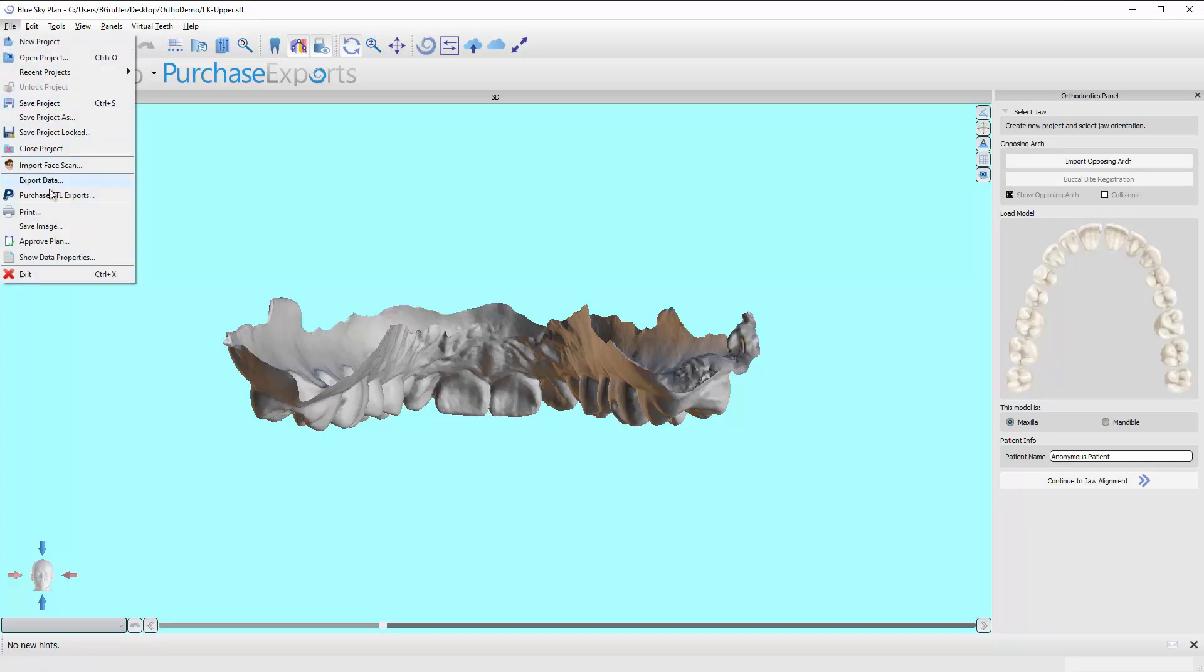There's other things available if you need to purchase exports. If we're all done designing this case and decide to move forward and export the case, it's going to use one of our exports. An export is basically the way the software is monetized. You can download it for free and tinker with it, but if you want to output the files from the orthodontic module it is a per case fee.